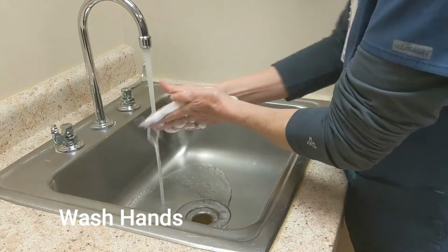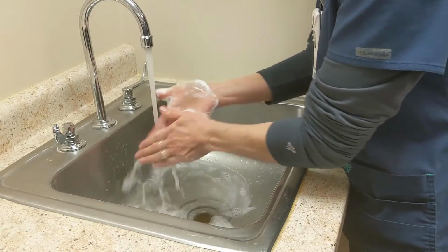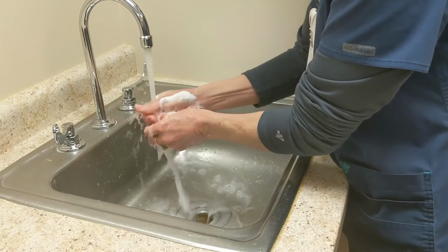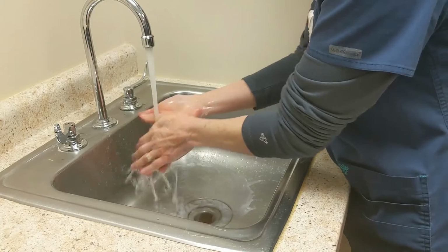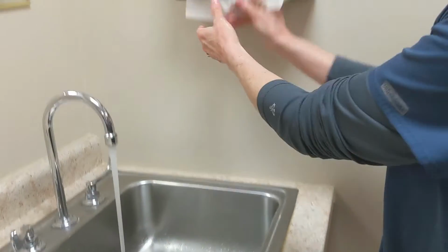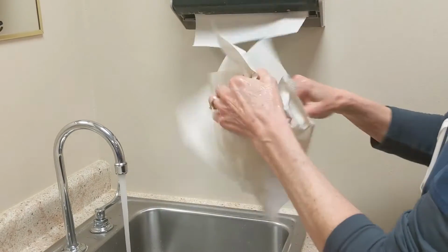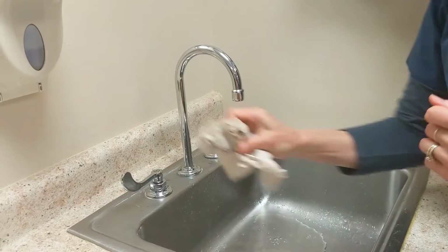Apply enough soap to cover the entire surface of your hands, using enough friction to really get them clean. Making sure you have a clean area and clean hands during every step is very important to prevent infection. If you don't have access to soap and water, use an alcohol-based hand sanitizer. Rinse them well and dry with a paper towel or clean hand towel, and use that same towel to turn off the faucet.